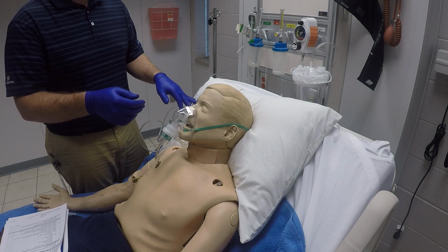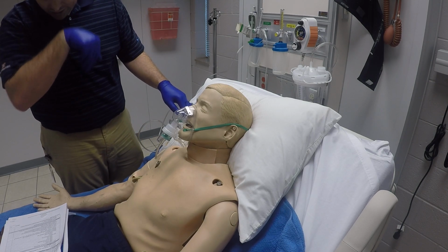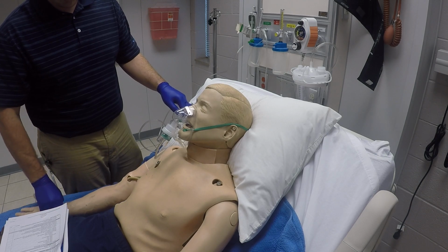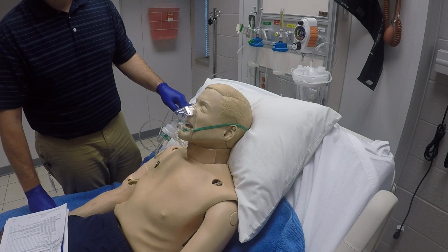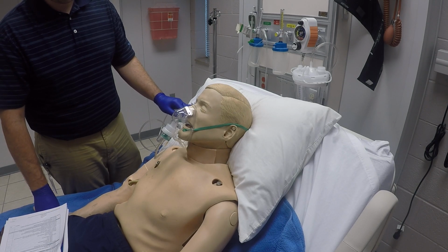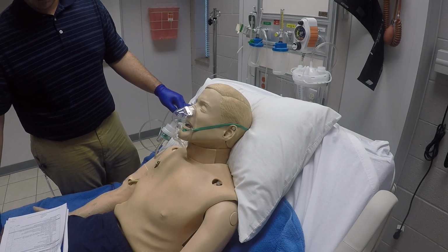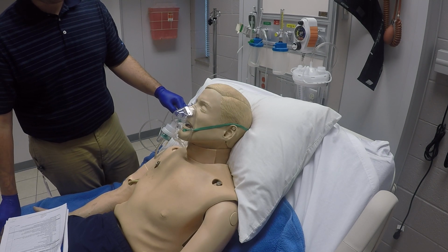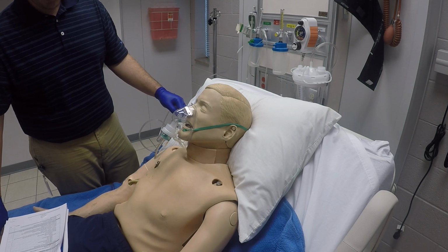We are getting a good mist in there. You check that before and after you put it on the patient. Make sure that you're getting desired effects from the patient and that there are no adverse effects with our medication that we're giving to them. And then we want to continually reassess that they are getting proper oxygenation. If we need to place something else, some other supportive oxygen on them, we can do that also.